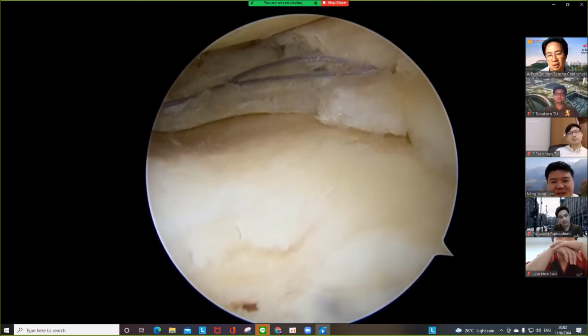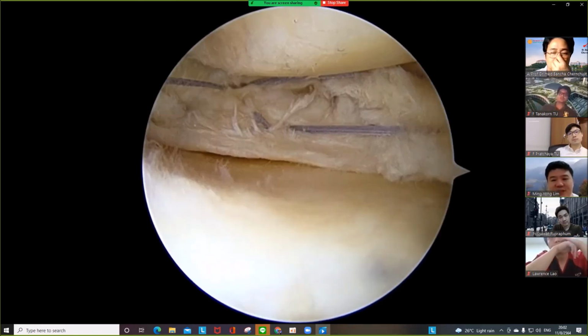What implant is this, Dr. Bancha? Johnson, I think. Johnson.